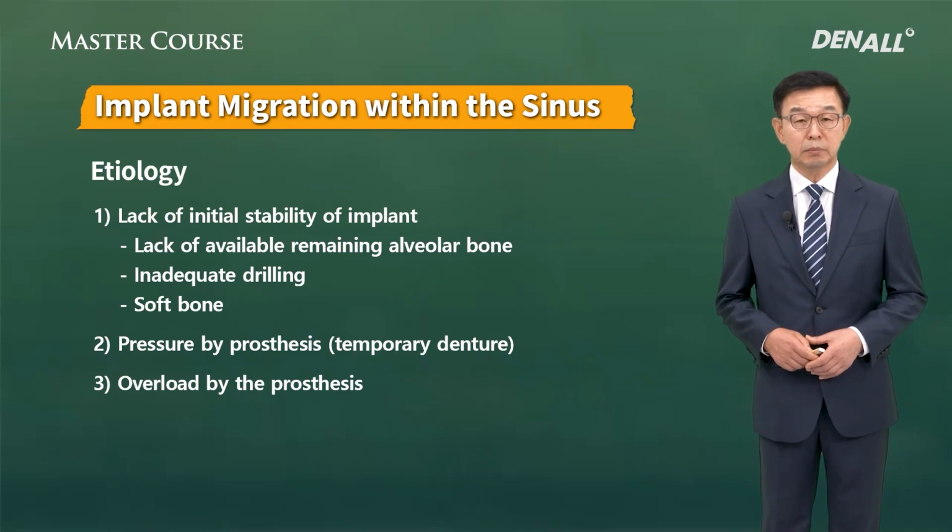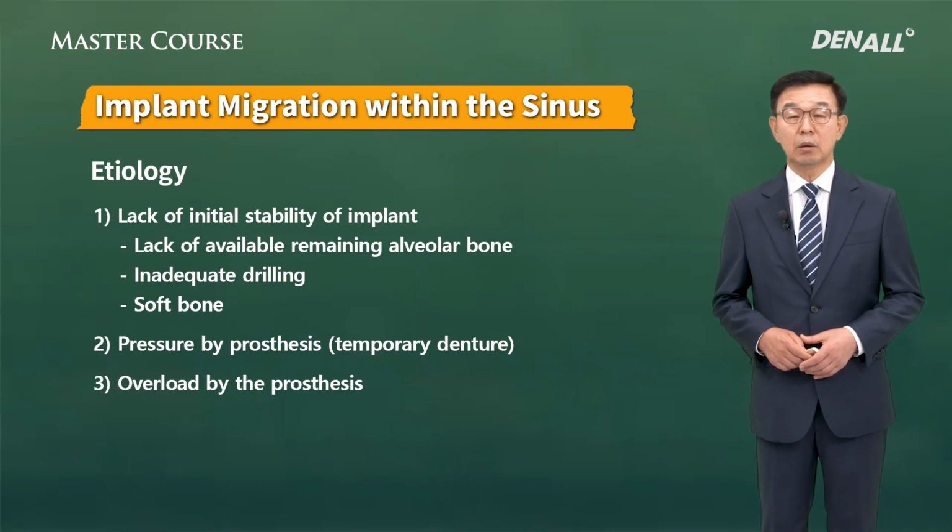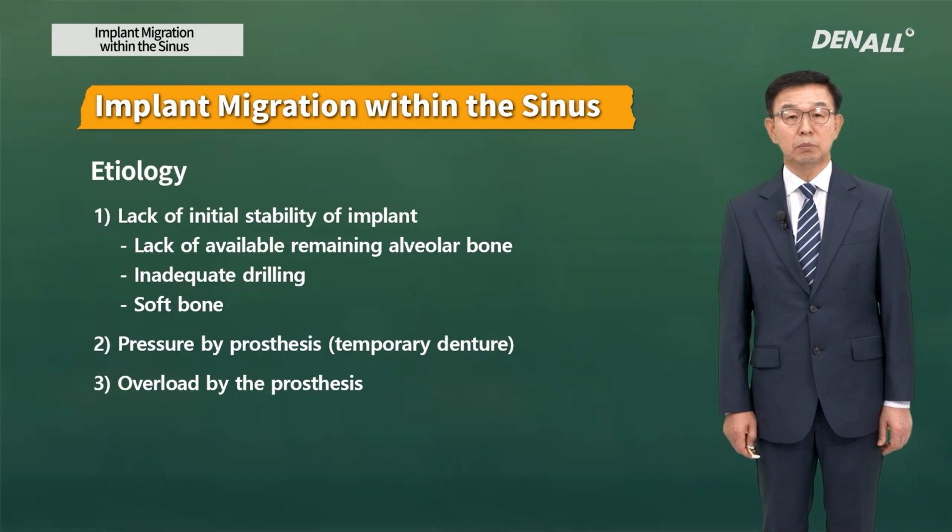The final instance is quite rare. However, after the final prosthesis is delivered and occlusion is formed, the implant can migrate into the sinus. It's quite rare, but it has been observed.